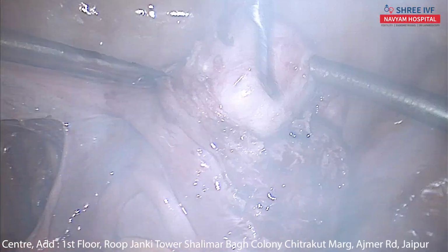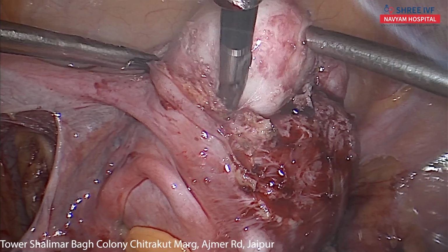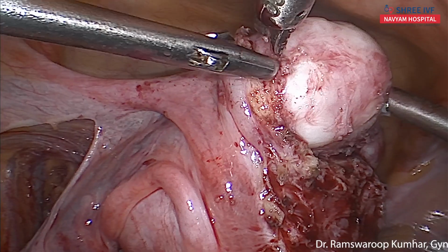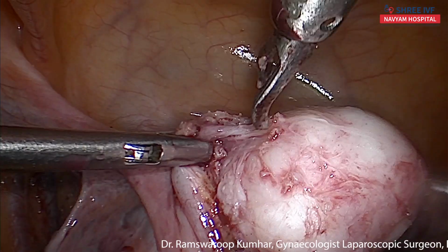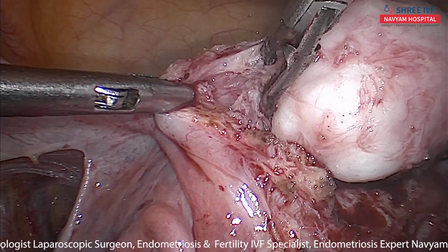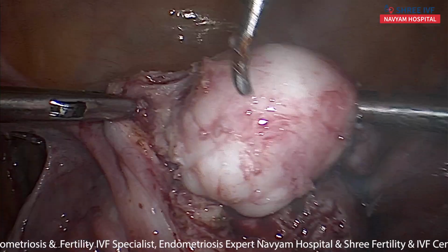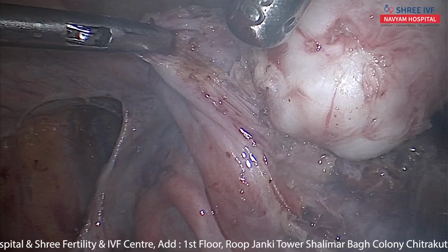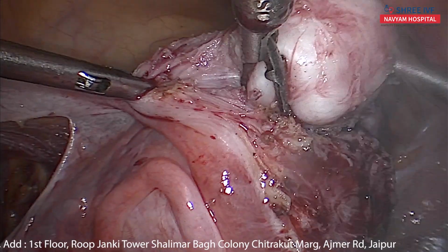Leave a little behind. These few fibers are remaining, and the whole myoma is coming out. The most important prerequisite is to remain in the proper plane, and proper traction and counter traction is the key for myoma enucleation.